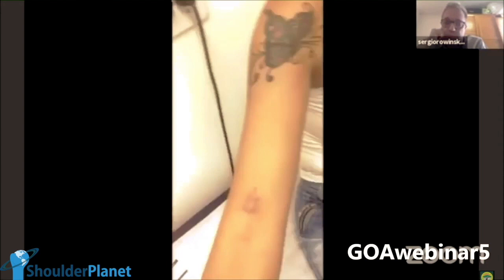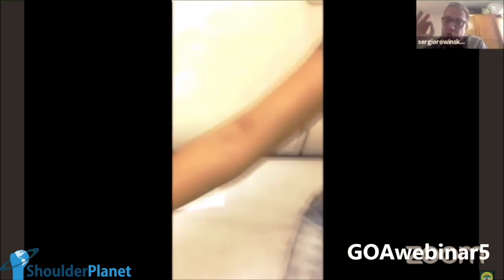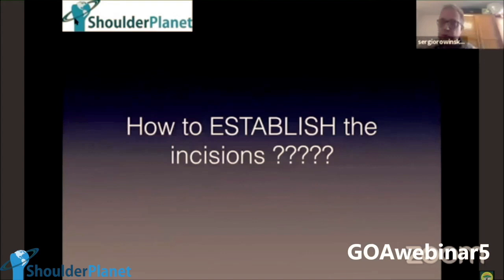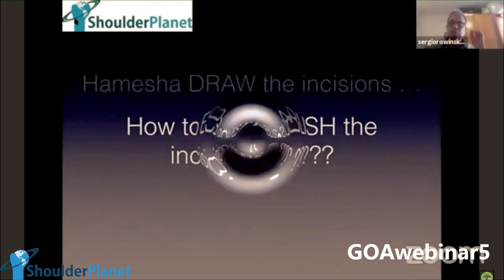So the first message: you can do it in any pattern. I'm going to show other patterns. So now I'm going to talk about the technique, and then I'm going to show three other very nice cases in different patterns and ages. So you have to draw the incisions for them to be in perfect position and very small.